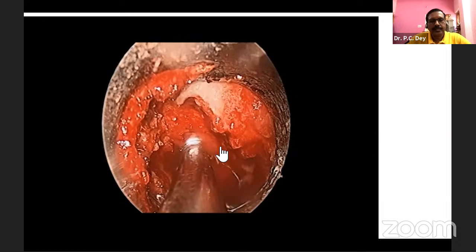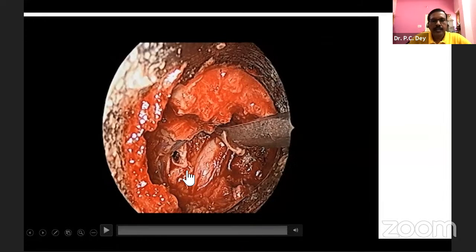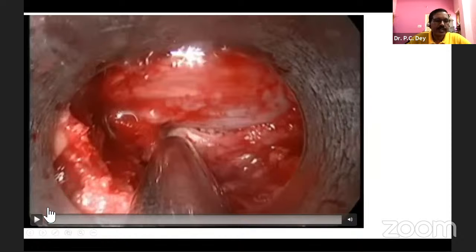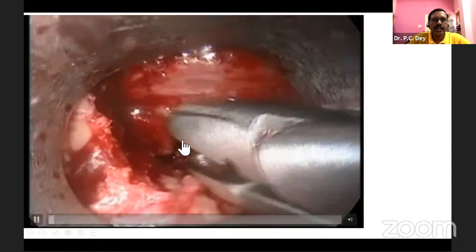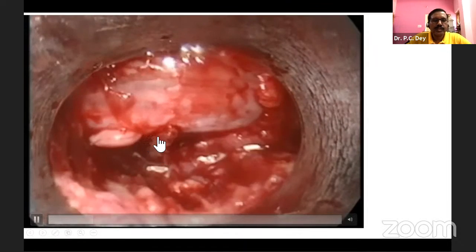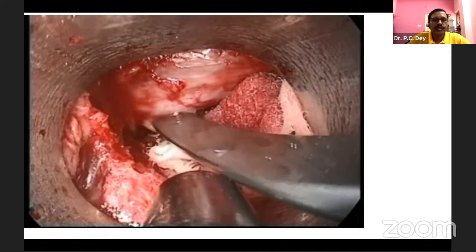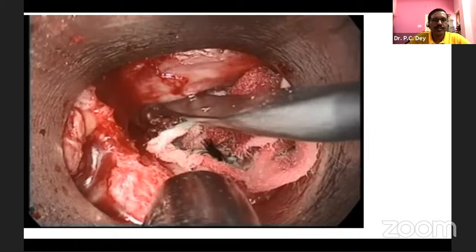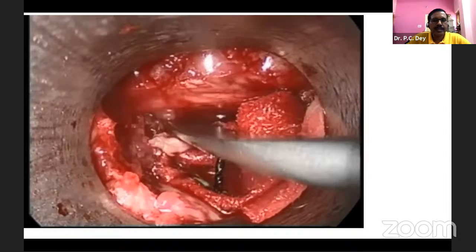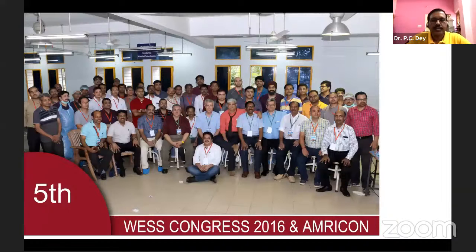And this is the end of the surgery with the nerve root. This is the nerve root, and this is the disc. So this is the final point: all these spinal surgeons used to face dural tears regularly. This is a herniation of the nerve root. Try to push the nerve root with the muscle patch, because it is a very small tear. We used to face very small tears of only 2 to 3 millimeter. So the muscle patch helps to push the nerve root, that herniated part, into the sac, and then seal with the surgical sealant. Thank you.